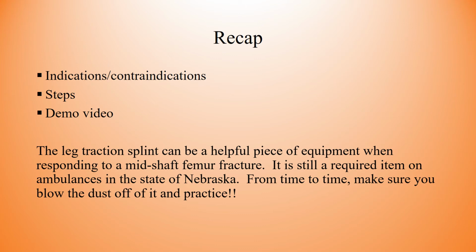So today we went over a few indications and contraindications, signs and symptoms of femur fractures, and the reasons for applying the leg traction splint. Then we went over the steps and also showed you a demonstration video.